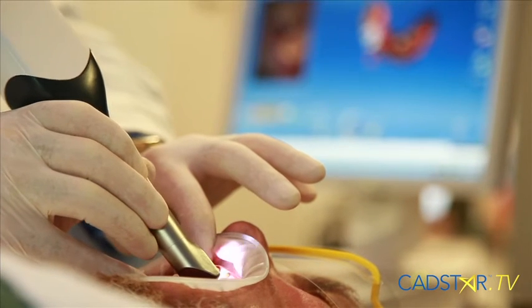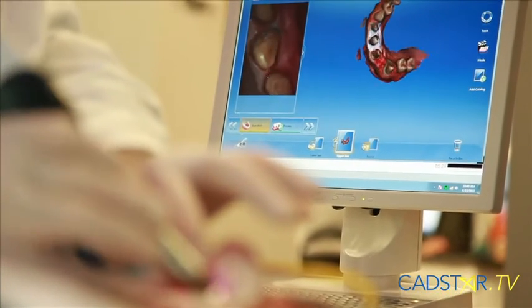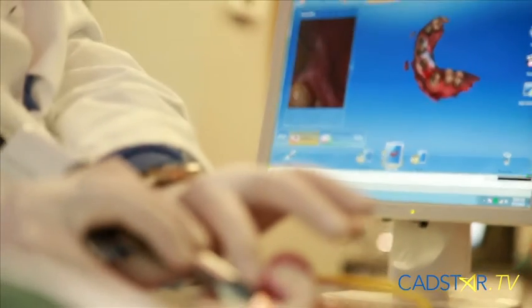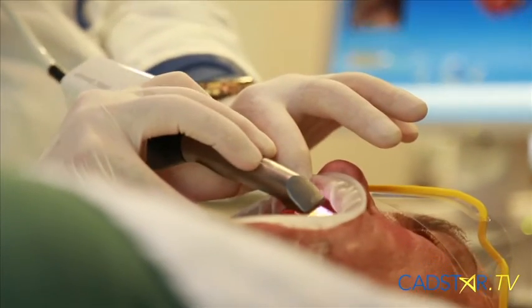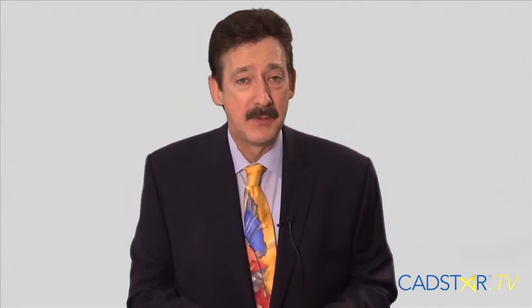We need to have it calibrated. The question is when — we're still learning that process. Think of it this way: if your camera's not working right, or maybe your restorations aren't seating the way they had been, or maybe you've had an earthquake, or you're moving your camera and your tower bumps the wall, or maybe you drop your camera and catch it in midair — we've all done those things. I do love my Omnicam.